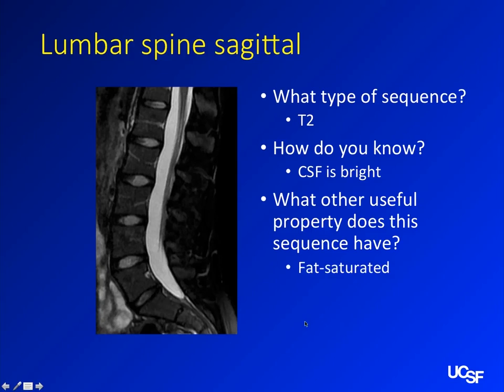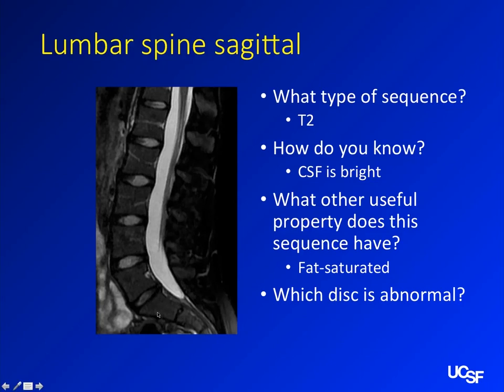Of these discs, which one is abnormal? L5-S1 is the abnormal disc. On T2 images the disc should be fluid-bright — not quite as bright as CSF — but this one is not as tall as it should be and not as bright as it should be. That's disc desiccation — you've lost the water signal in that disc. Here's a normal one and here's an abnormal one.